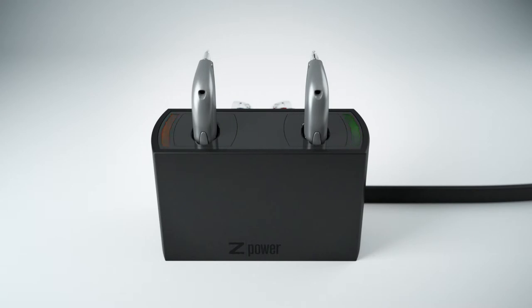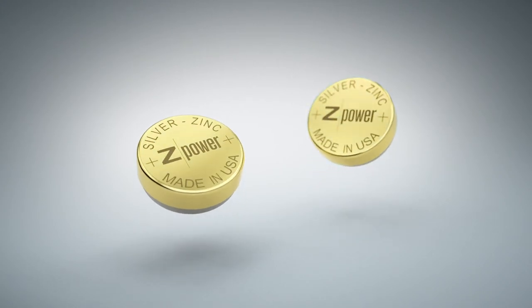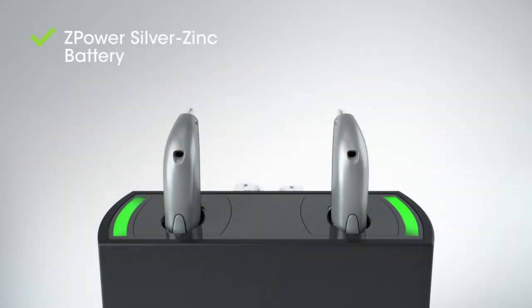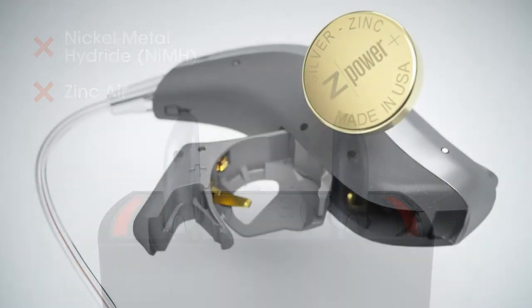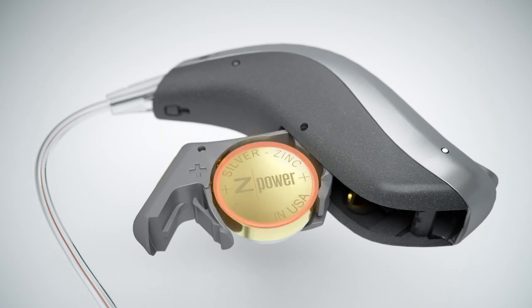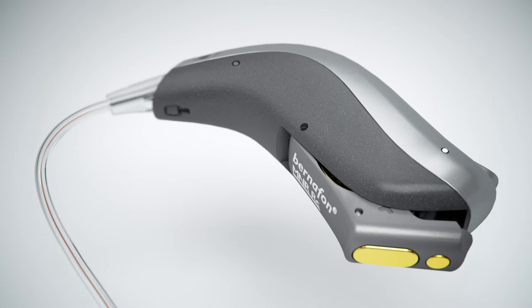If one or both lights are blinking red, please verify the hearing aid batteries are Z-Power rechargeable batteries. You can see this written on the batteries themselves. Your charger will detect the chemistry of the battery and not charge them if they are the wrong chemistry. Replace the normal batteries with the rechargeable batteries and follow the normal process to charge your hearing aids.